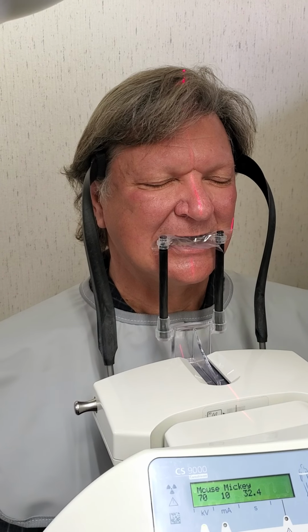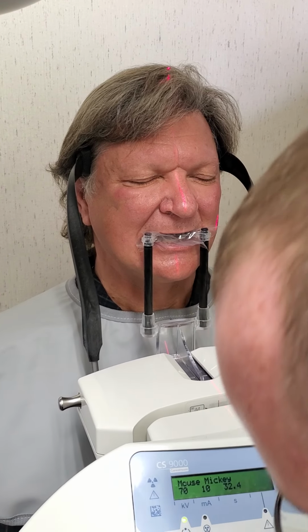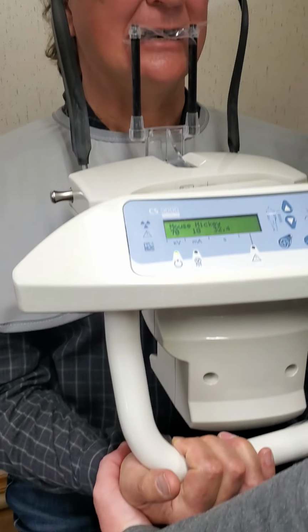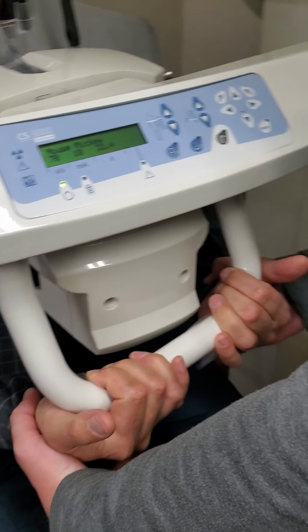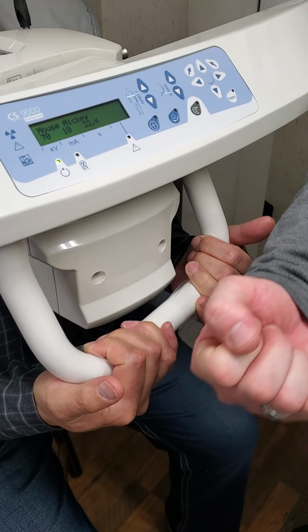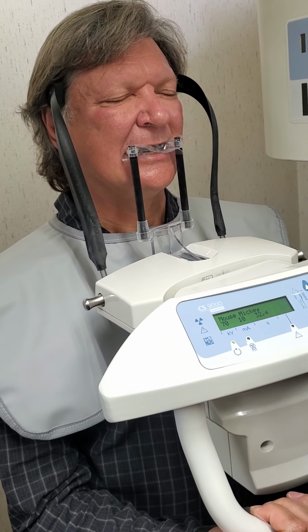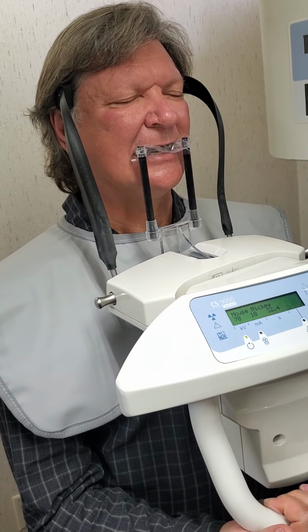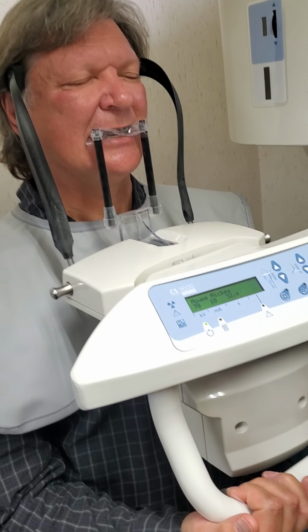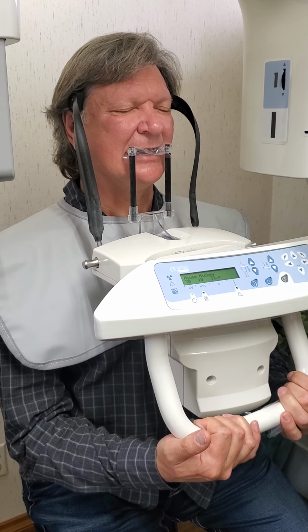So the last part, since we have your patient sitting up nice and tall, is to physically bring your patient's hands up to the hand grip. And it's an under grip, not an over grip, because they're not going to know where that is. The key to the under grip is that it causes their shoulders to come down, whereas if they're here, that forces their shoulders up. So you want their shoulders down, out of the way of the machine rotating around.